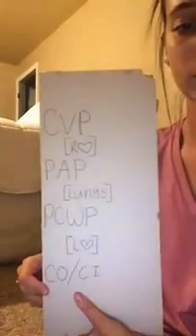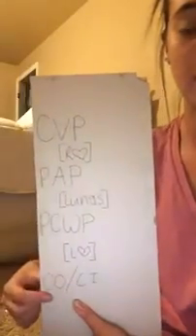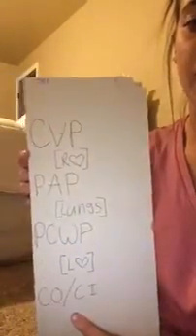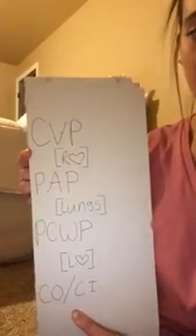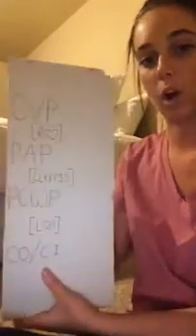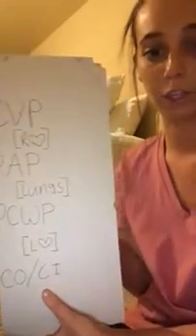Also, I can't remember if I said it, but if all of your values are increased or all your values are decreased, this could also mean something. If they're all increased, that could mean fluid overload, so you would just diurese your patient. And if they were all decreased, that would mean dehydration, so you would just give blood or fluid, whichever the patient would need.